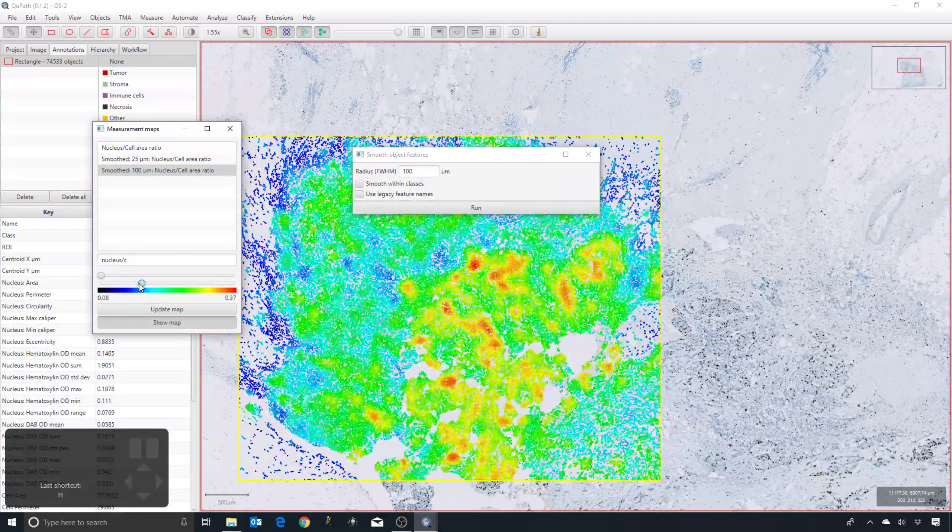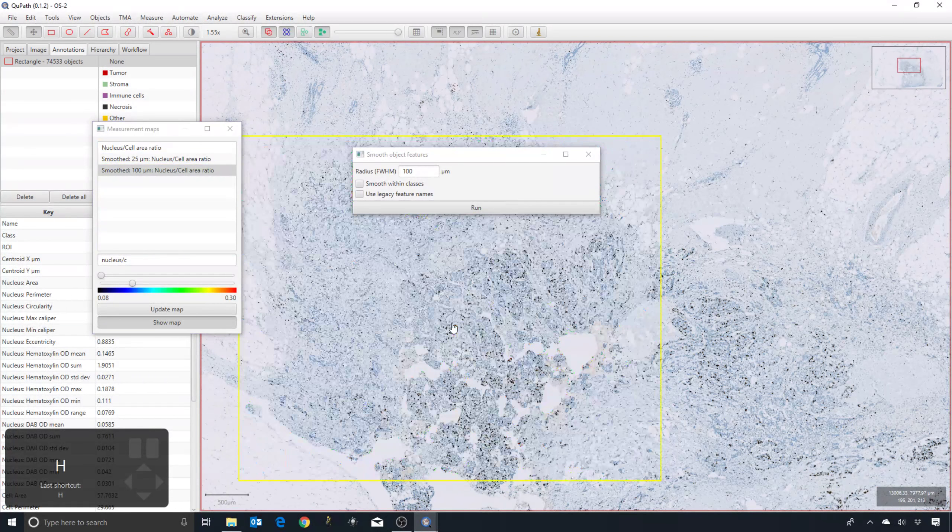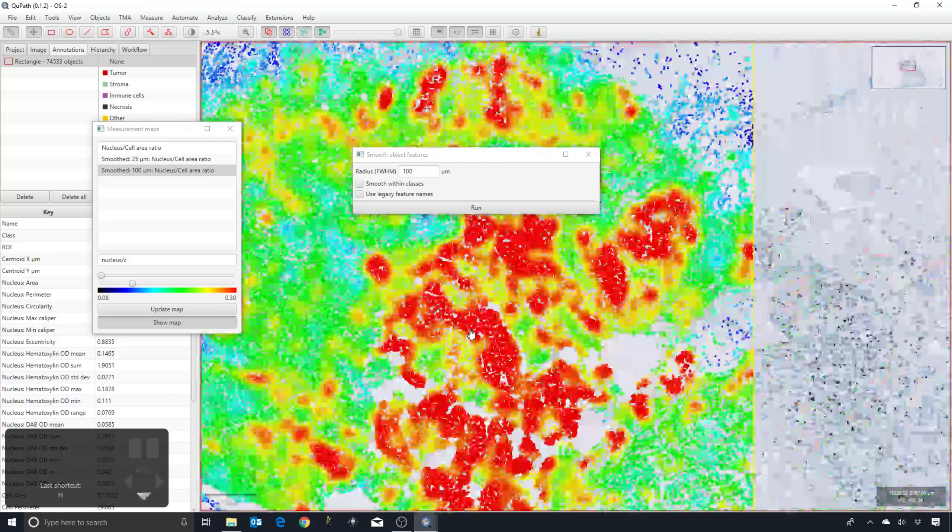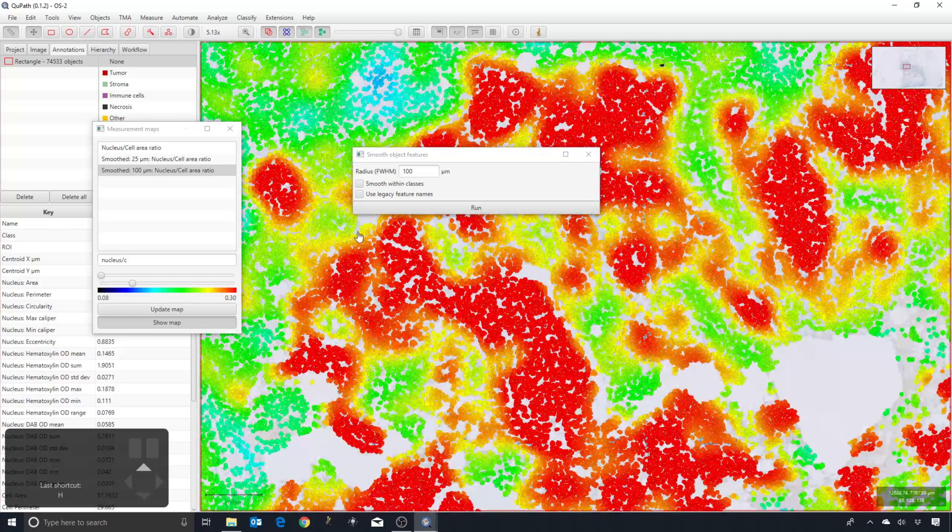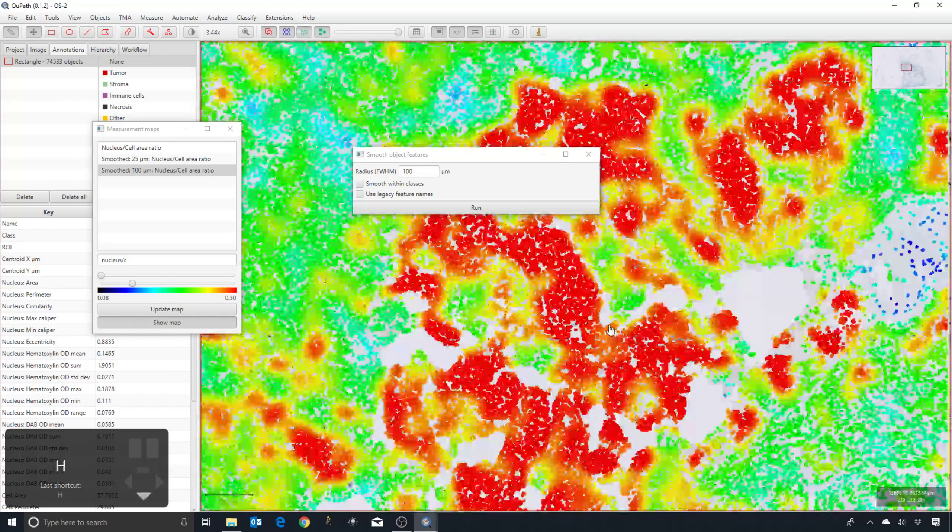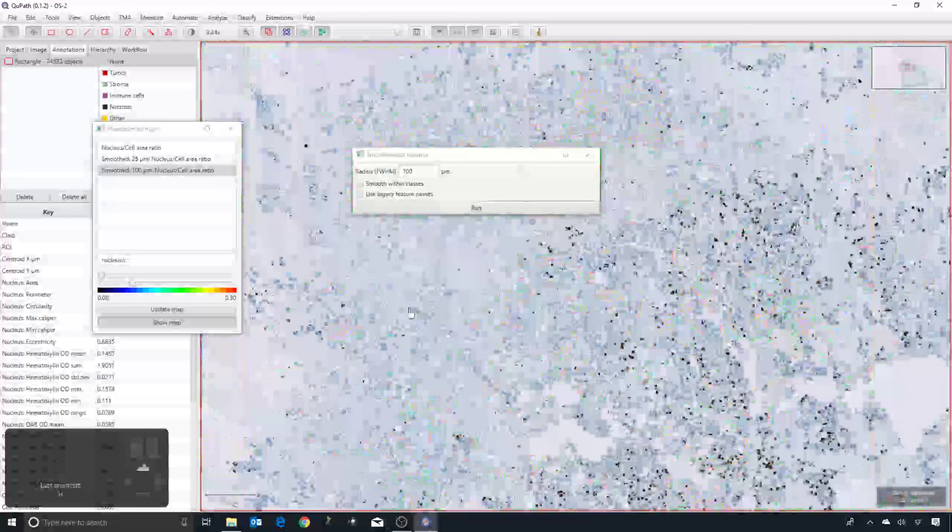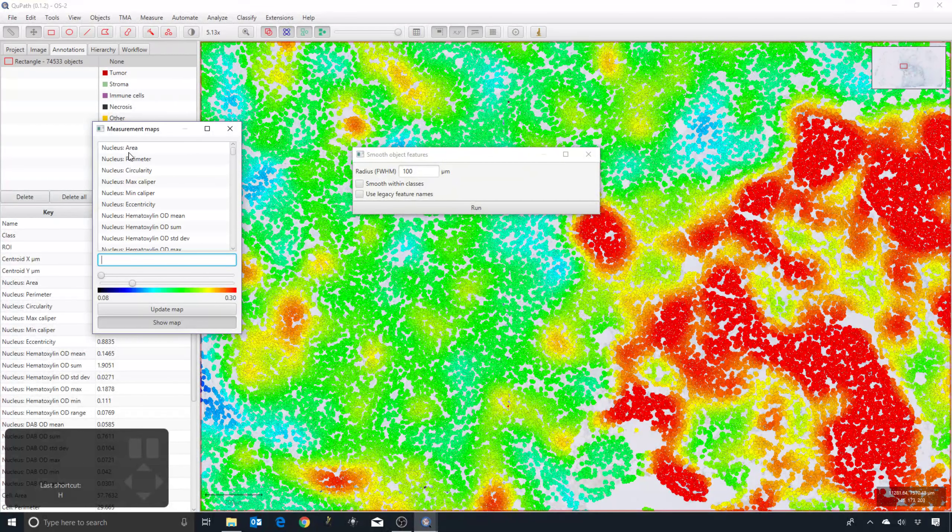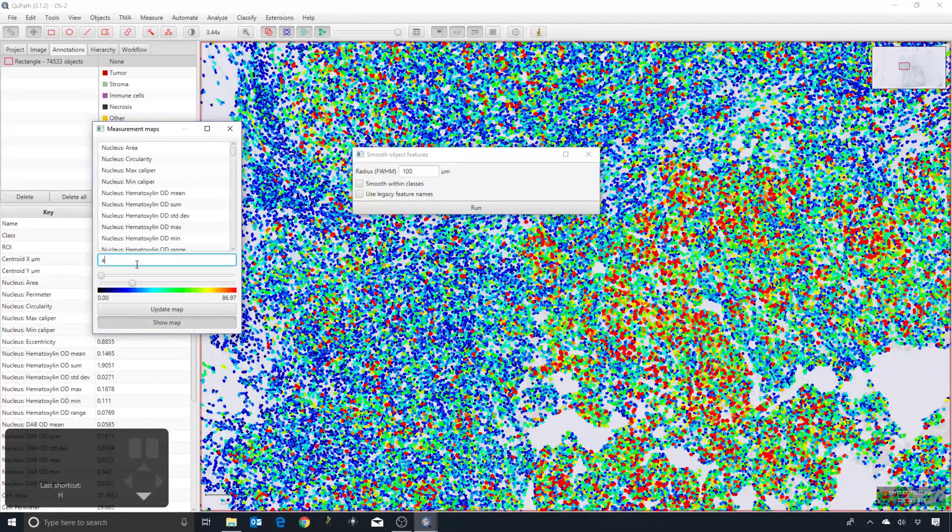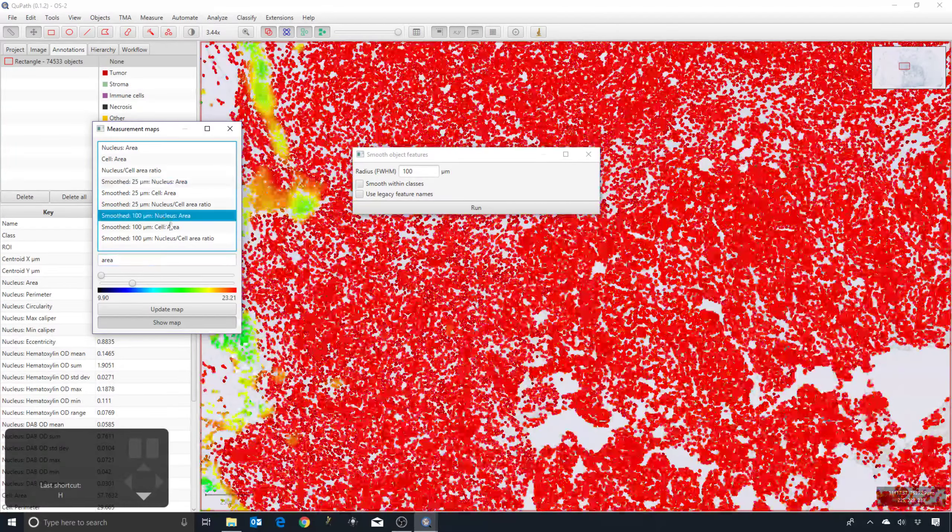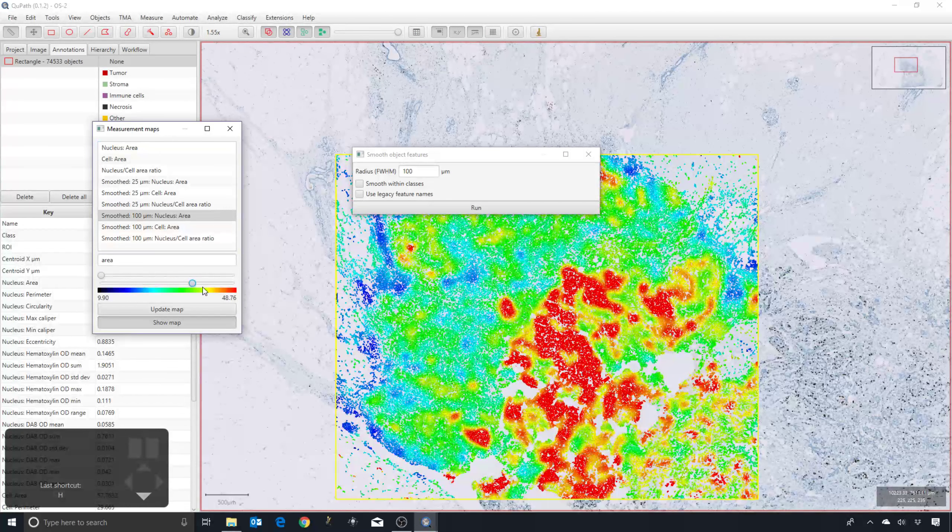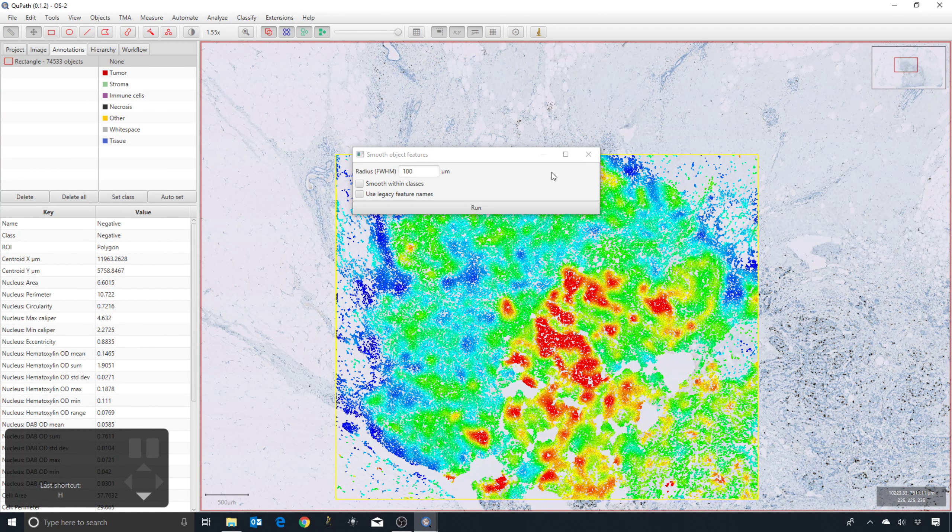This may or may not be useful, but we'll be able to see that in a moment. What you should be able to see is that the measurements are high in areas of particularly distinct cell types. If it's not necessarily the nucleus cell area ratio, the nucleus area might be informative—perhaps becomes more informative whenever smoothing is applied. That gives a way to visualize it.